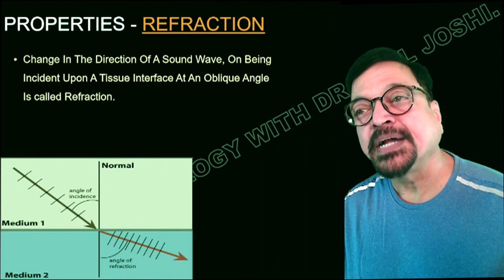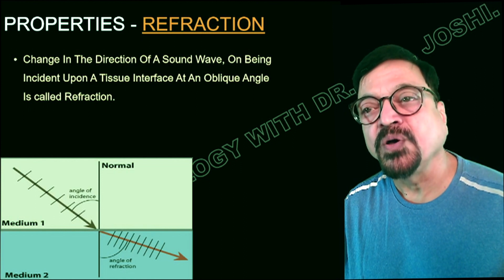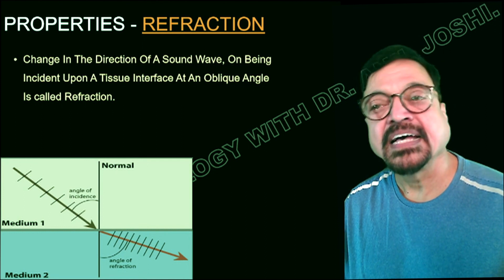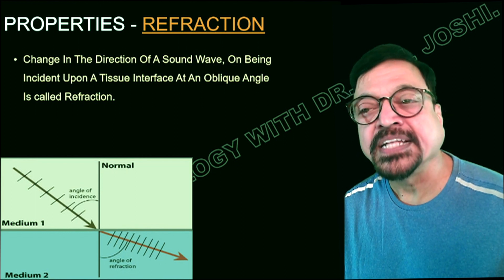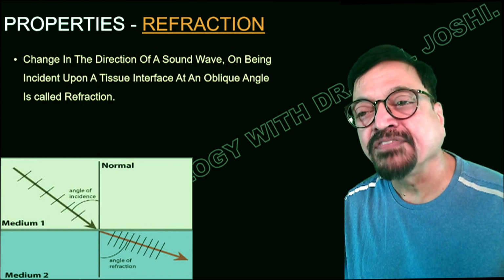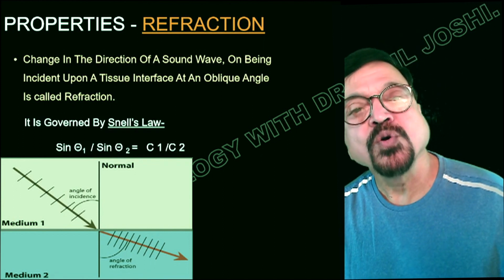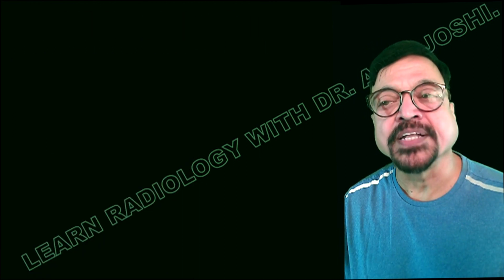Now, the next property is refraction. Change in the direction of a sound wave on being incident upon a tissue interface at an oblique angle is called refraction. You can see in the diagram the incident ray, or incident ultrasound wave, how it is coming and getting deflected. That will give you an angle of refraction. It is governed by Snell's law. For those who are interested, you can pause here and get a better idea of what Snell's law is.